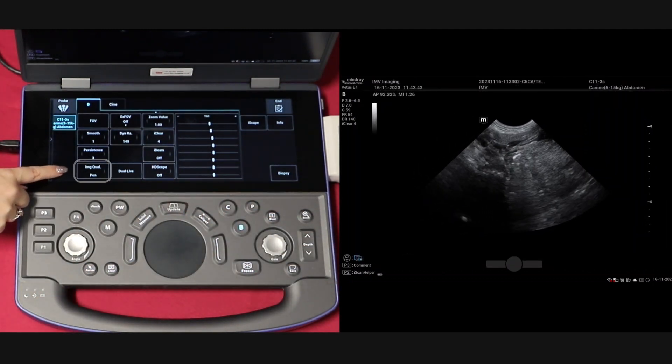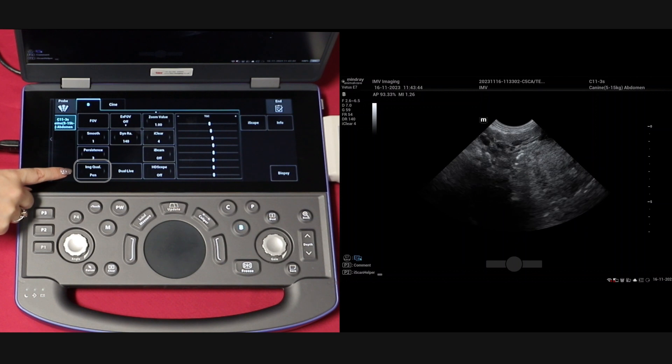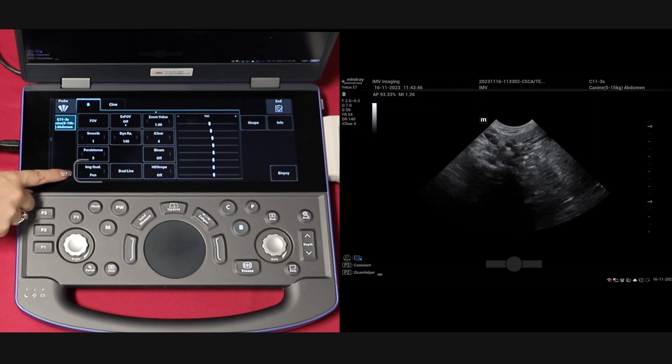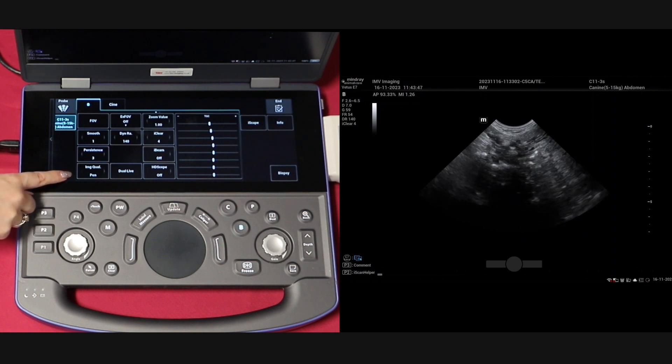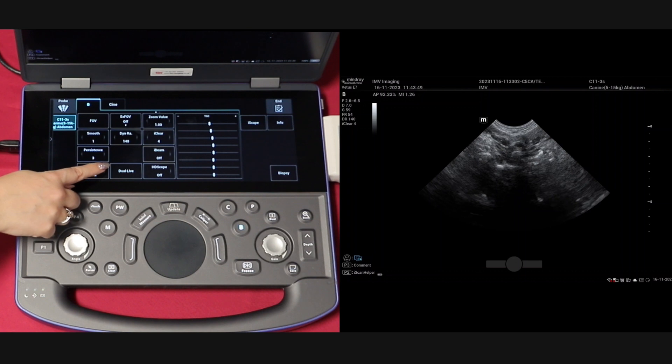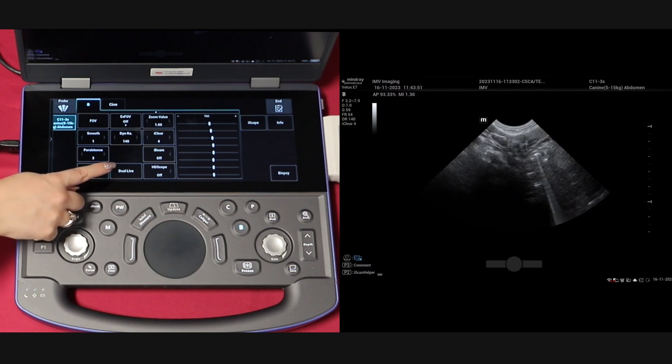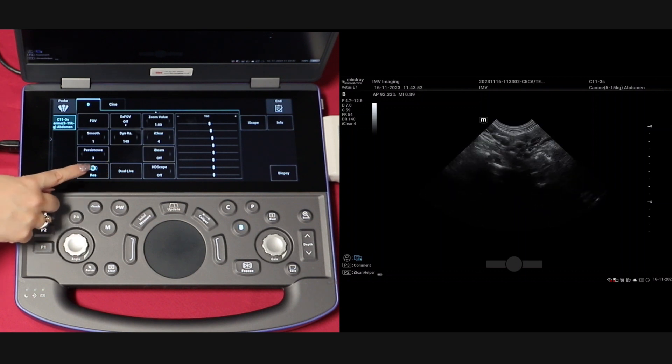Frequency is referred to as image quality on this system and is split into three settings: Resolution, General, and Penetration.